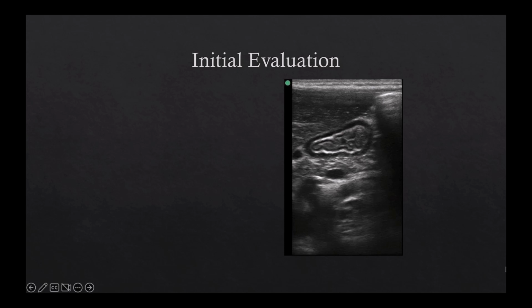This is a nice empty stomach. This would suggest that this patient is low risk from a gastric aspiration standpoint and can likely go ahead and proceed with anesthesia using whatever route is chosen, including a mask induction and standard intubation.